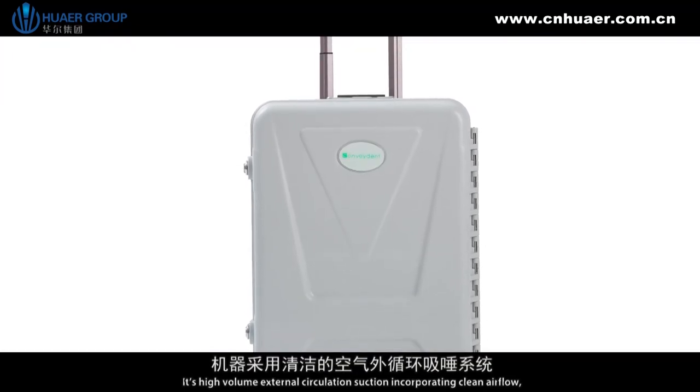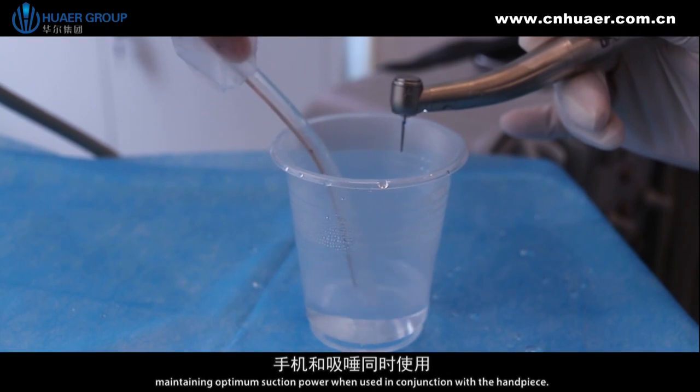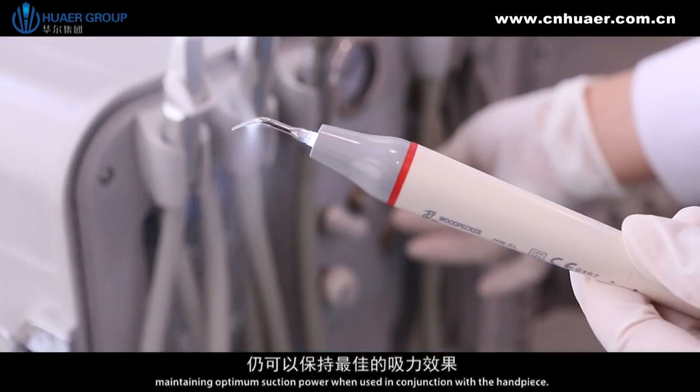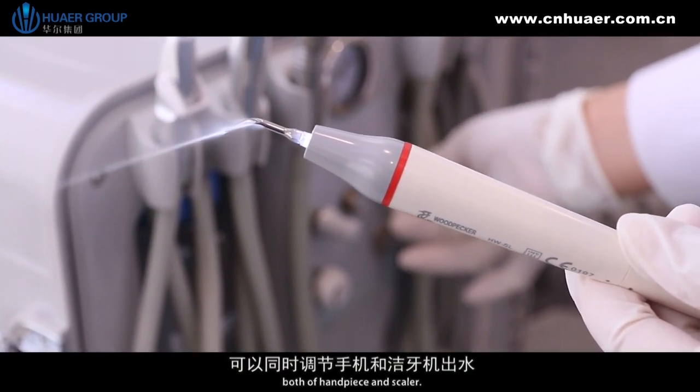It features high-volume external circulation suction incorporating clean airflow, maintaining optimum suction power. When used in conjunction with the handpiece, the water regulator is for adjusting both the handpiece and scaler.